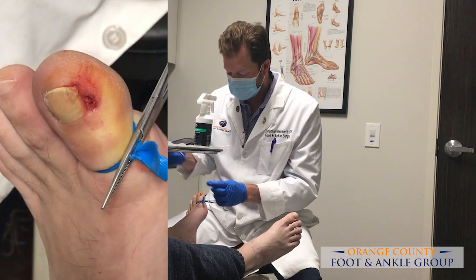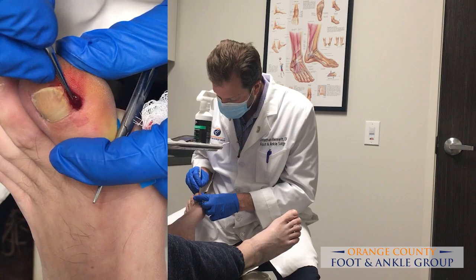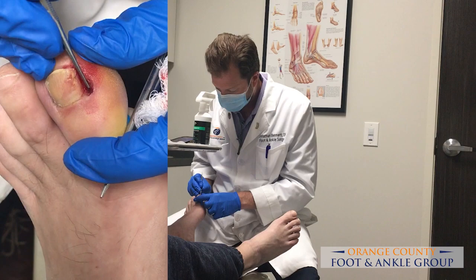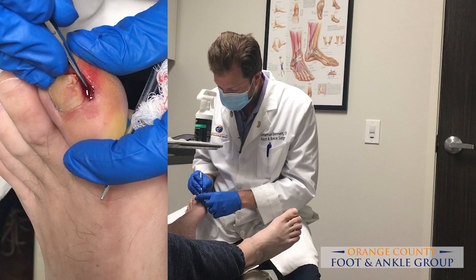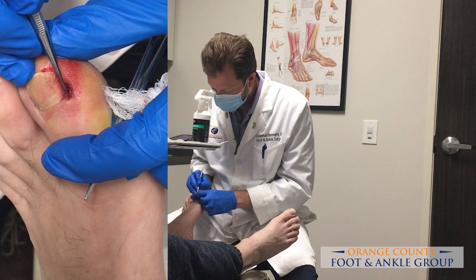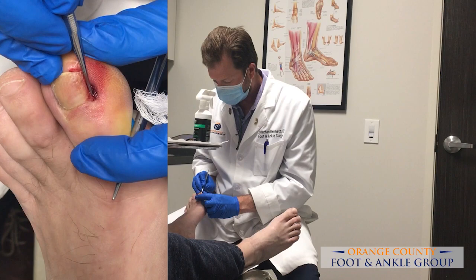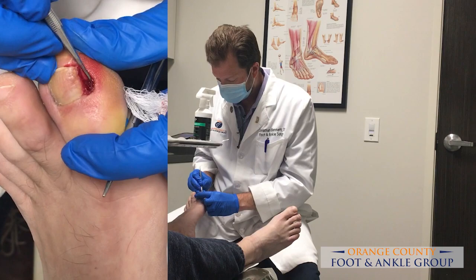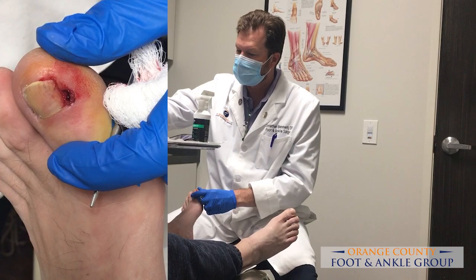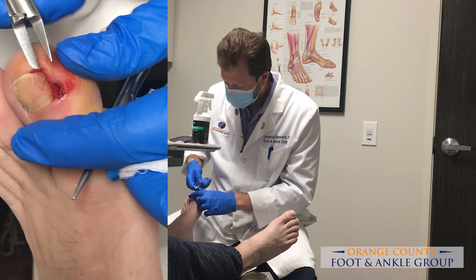Now we want to make sure that we got it all and there's no more, because these things can be pretty tough and resistant to treatment — sometimes they just want to grow back over and over again. So you want to make sure you've really gotten under there and gotten out everything you can. I don't really feel anything else, so that feels pretty good. He's still got some nail here; you can see his nail goes along in a straight line, but everything over this way has now been removed, so he shouldn't get that spicule anymore. We can clean it up a little — he's got a little bit of excess skin there that we might want to get rid of just to clean it up.